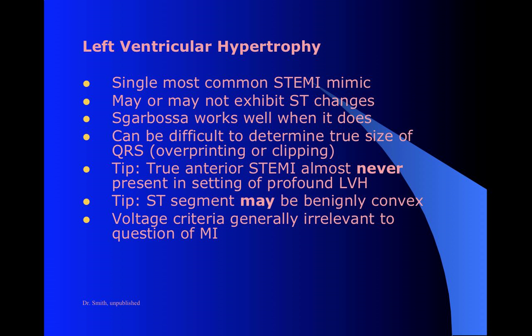If you were a cardiologist, you would be diagnosing LVH, perhaps with other diagnostics, but from the EKG you would do it by actually measuring some of these waves and adding up some voltages. There are a number of different criteria for it. Generally, we don't need to care about it because it doesn't matter. These principles, like appropriate amounts of discordance, they apply whether or not it happens to pass as true LVH or not. So don't worry about that.